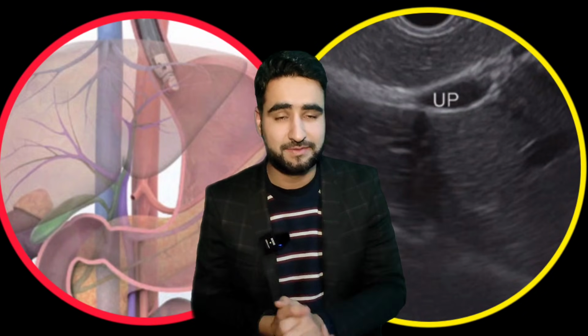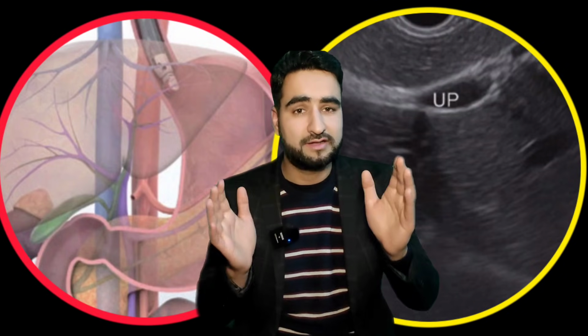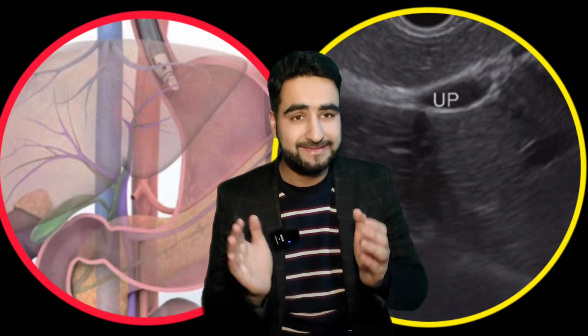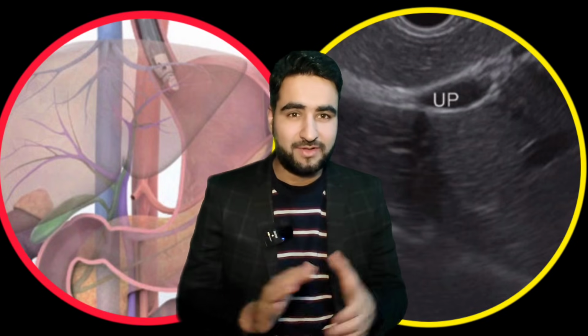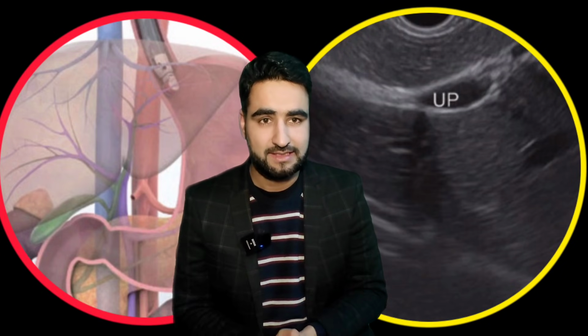The key principle is that liver segments inferior to the portal vein level are the inferior segments. And yes, inferior means left side on the screen. For optimal visualization of the left portal vein, a downward push alone isn't enough. Add a slight clockwise rotation to see it clearly as an anechoic structure with hyperechoic bright walls.